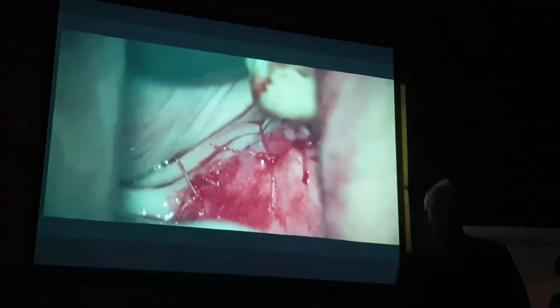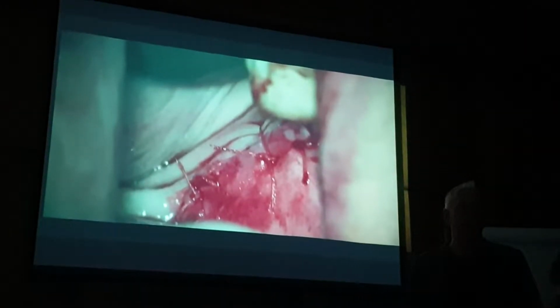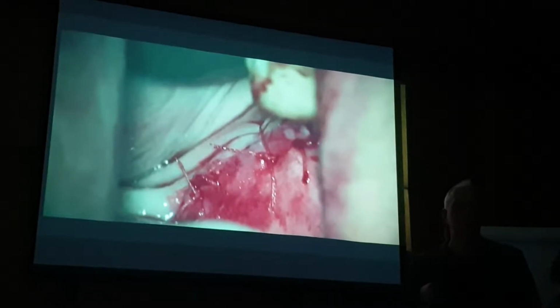Never rely on interrupted sutures alone to close these flaps. How often do your patients return and you find interrupted sutures loose or gone at the surgical site? You see it every day, right? It's because interrupted sutures are not meant for flap closure, they're meant for flap alignment.